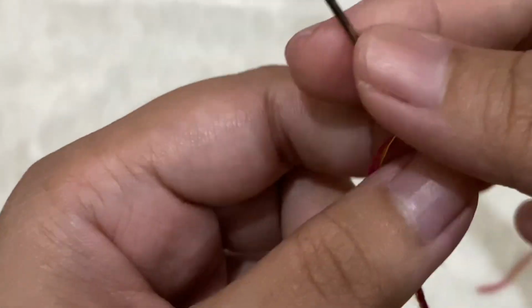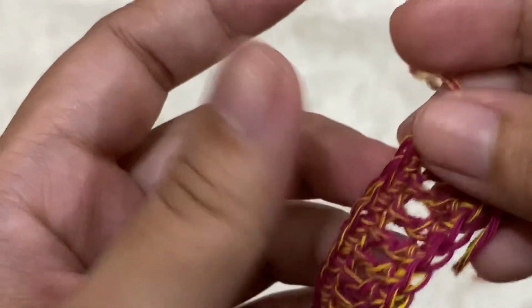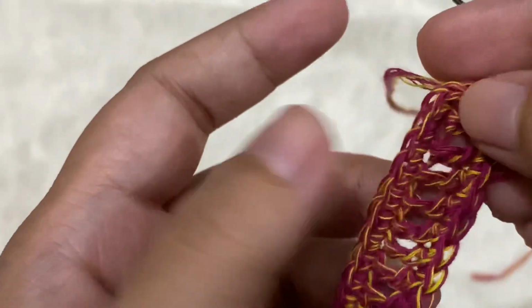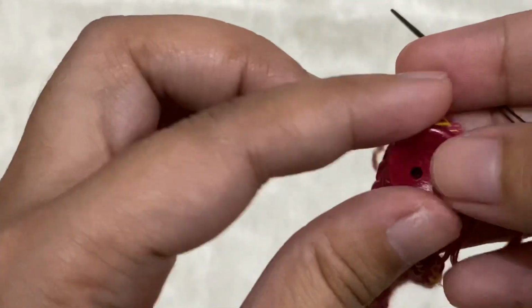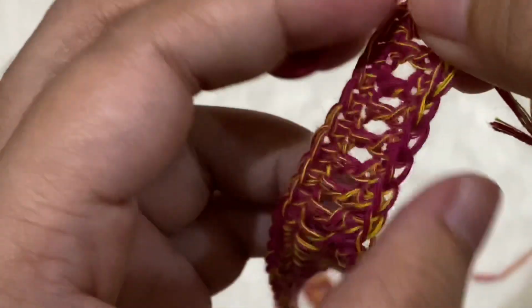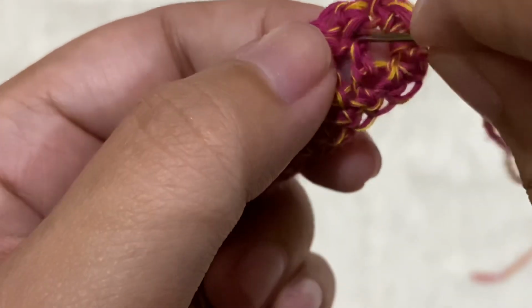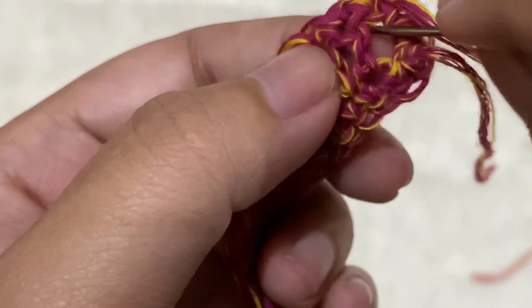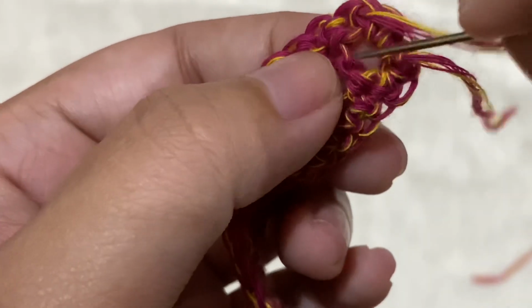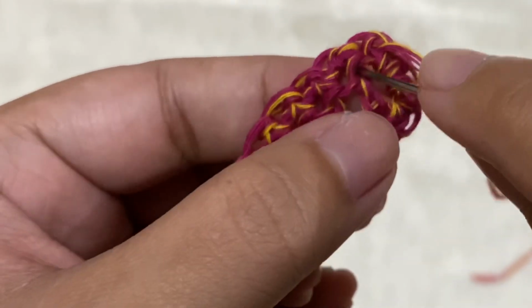So insert your yarn into your needle. So we're ready to sew the button now. Make sure that your work is facing up. I mean, the right side is up, because that's where we will put on the button. Okay, so just sew in the tail. So it's now on the wrong side, and go back in. Make sure that you insert your needle into a stitch, not on those gaps right there. I just think it's more secure if you insert your needle through a stitch.